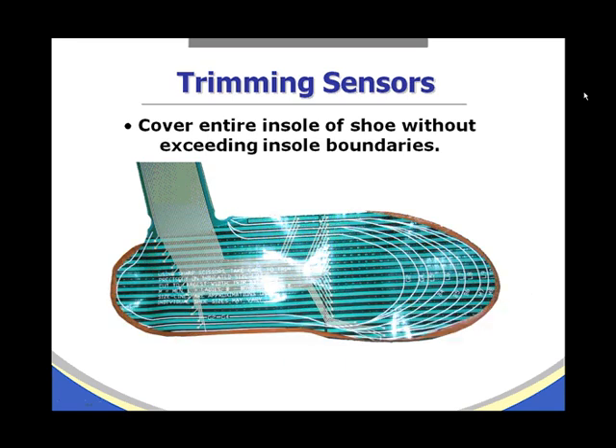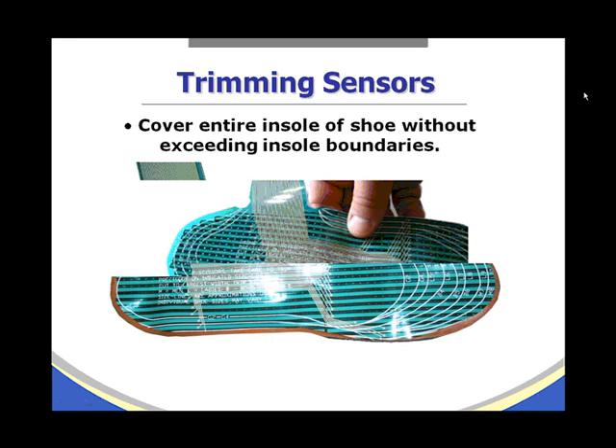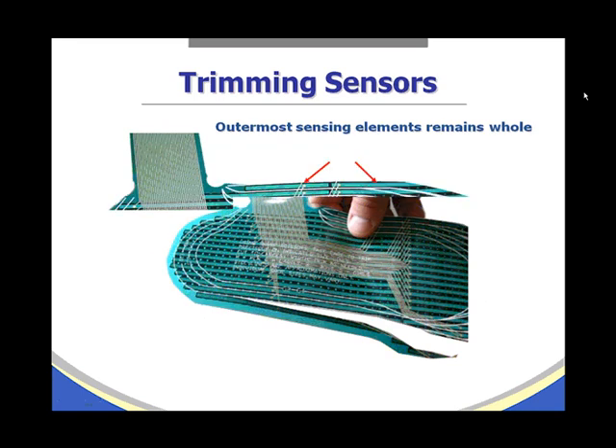Here is an example where the sensor covers the entire insole of the shoe without exceeding the insole boundaries. When cutting the sensor, especially in the mid-foot region, we want to make linear cuts between the sensing elements. The outermost sensing elements that we keep on the sensor should remain whole. You can see the linear cuts on both the top and bottom of the sensor in this illustration.